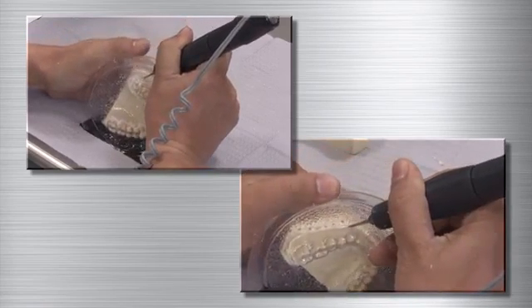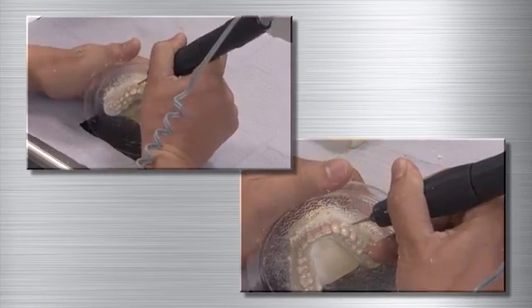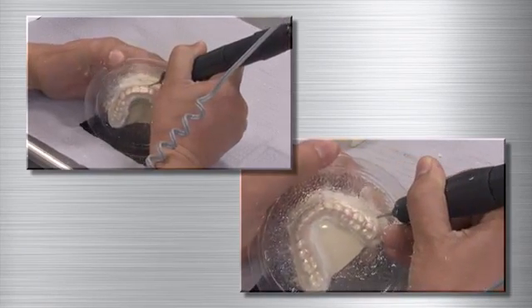Continue cutting the facial of the model. Stay about 5 mm away from the teeth, cutting straight across.